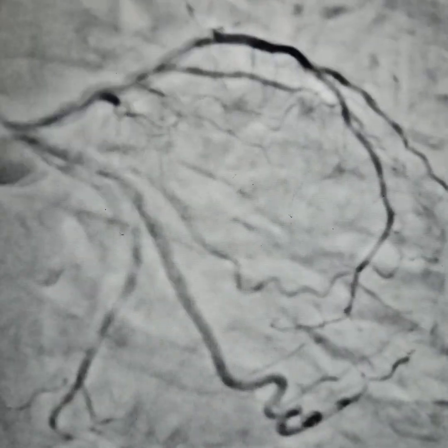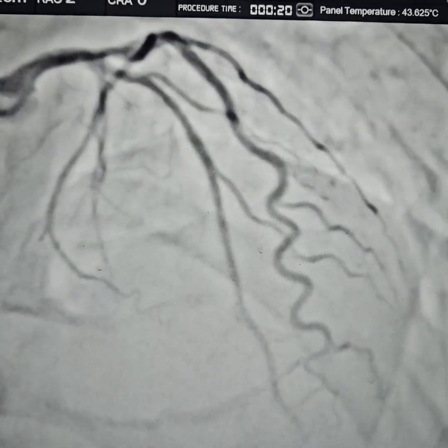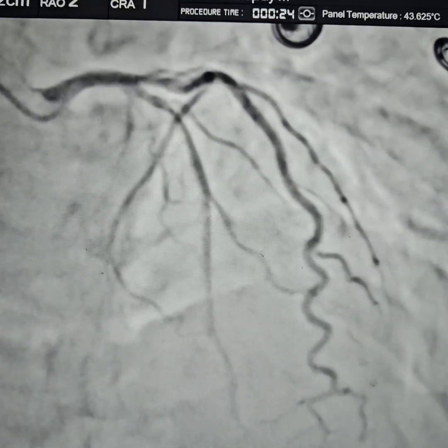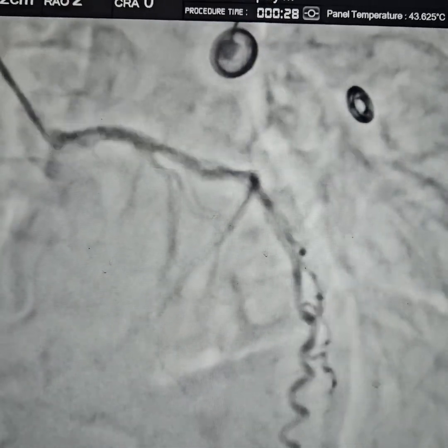This patient presented with a non-ST elevation MI. As you can see, the patient has a diffuse lesion in the LAD with slow flow. The lesion is about 80% in the LAD and we decided to stent the patient.